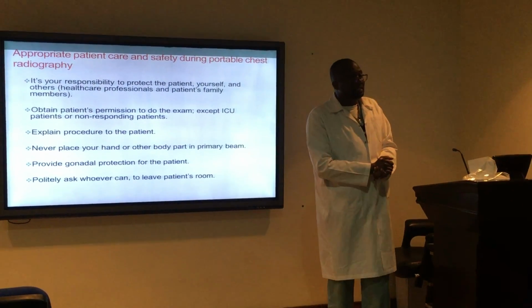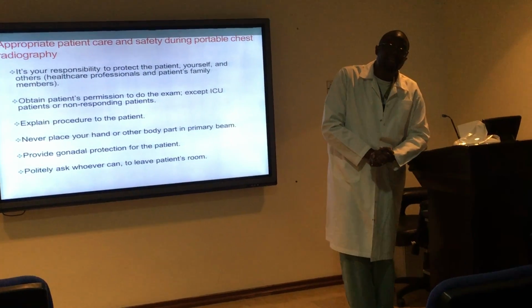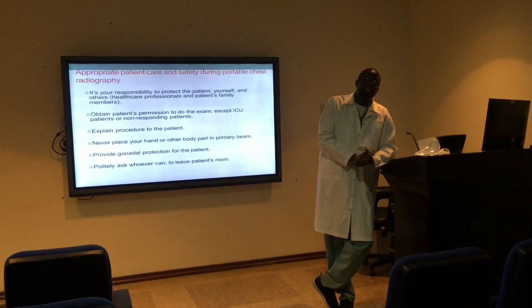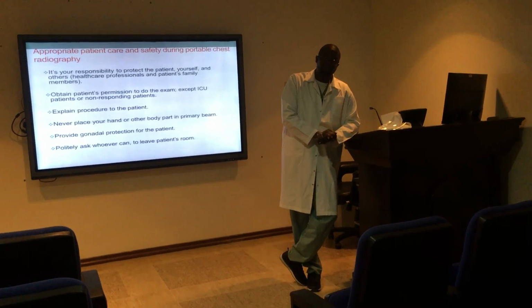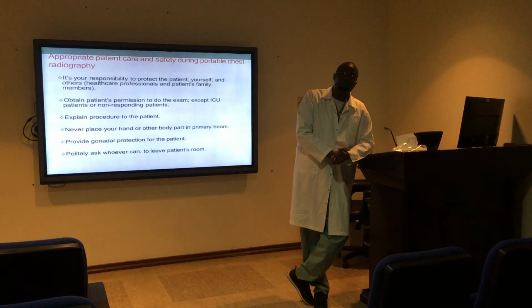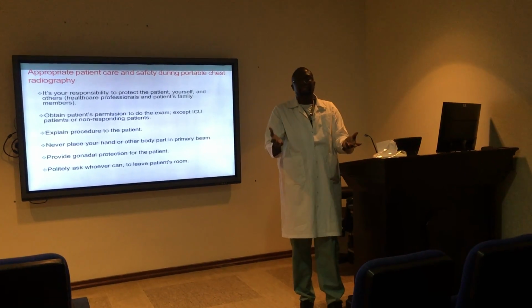If you can communicate with your patient, try to obtain their permission for the exam, because our patient has the right to refuse an exam. All you have to do is inform the primary nurse. But in the case of an ICU patient, what do you do? You have to communicate with the primary nurse, as I've spoken about earlier. You have to check whether this exam was actually requested for the patient or not, because sometimes there could be a double requisition. So, to prevent unnecessary radiation for our patient.